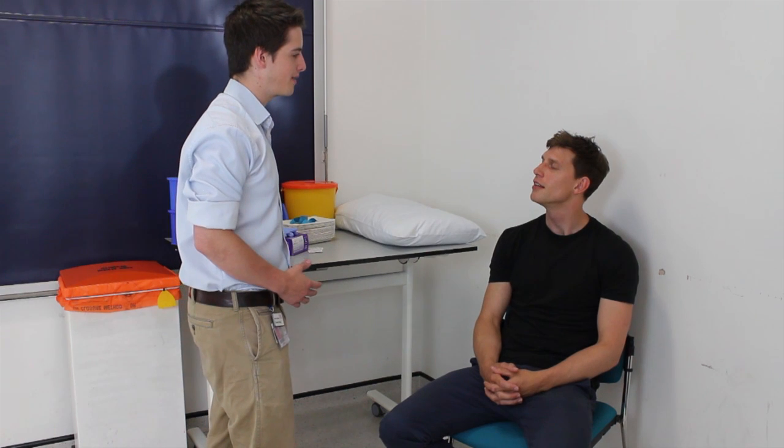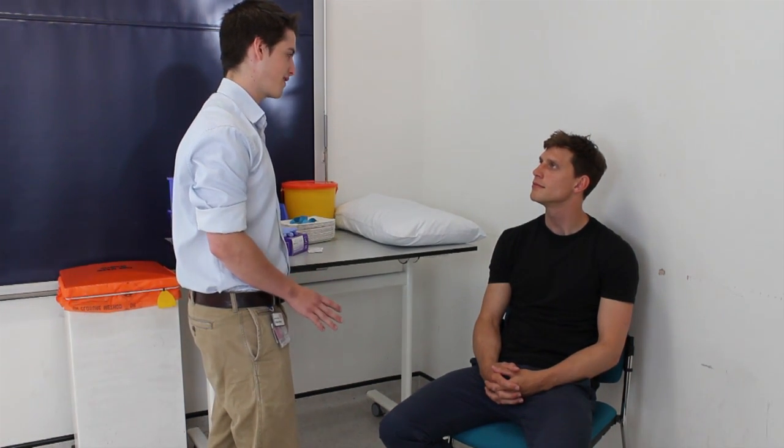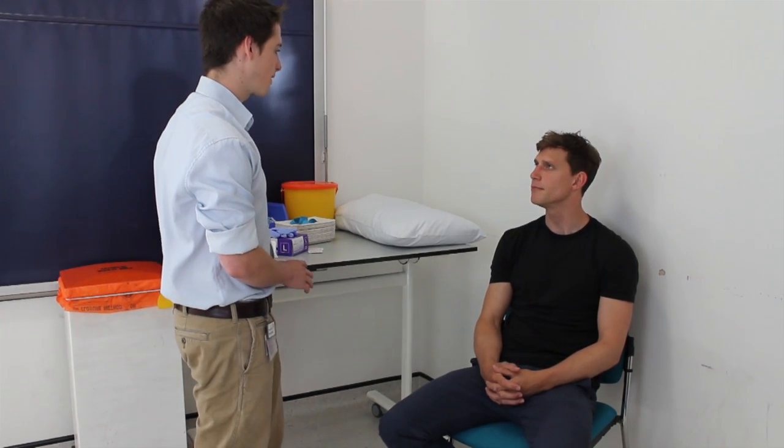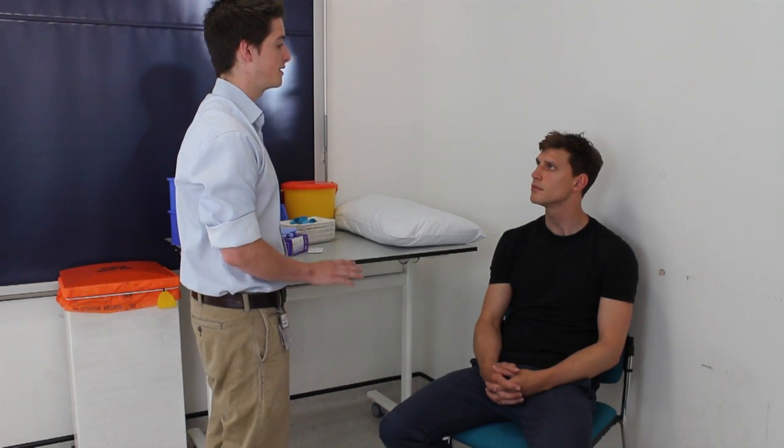Hello sir. Hi there. My name is Charles Wood. I'm one of the final year medical students in the hospital and I've just been asked to come and take some of your blood today if that's alright. That's fine. Have you ever had this done before? I have done, yeah. So as I'm sure you know, it'll just involve me attaching a tight band around your arm and there'll be a sharp scratch while I take some blood, but it shouldn't be painful at all, and if it is, let me know and we'll stop whatever it is that we're doing. Okay, that's fine, thank you.